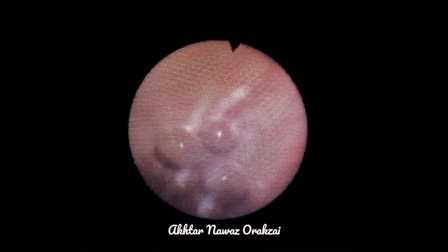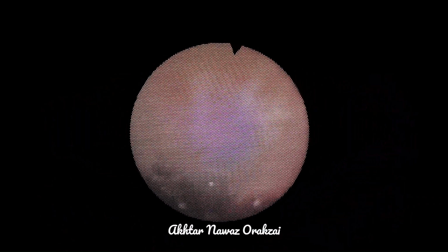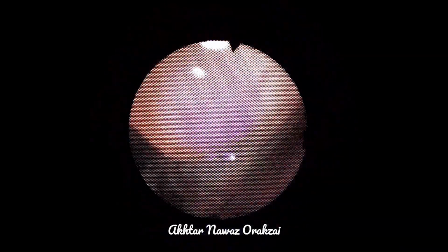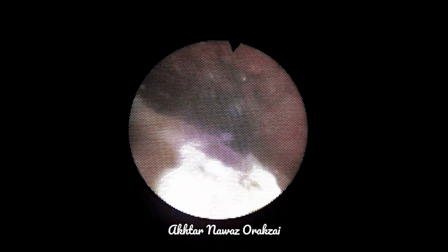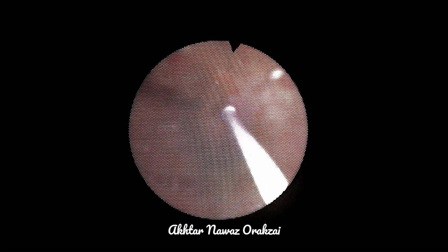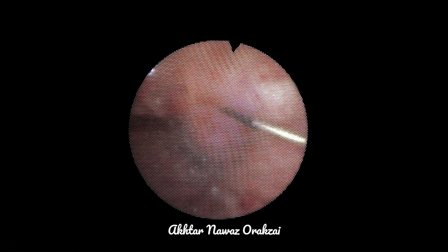Here the patient's age is around 70 years, and he had a road traffic accident where he lost one leg. He had an above knee amputation, and he made this stone. So this is the puncture suprapubically under vision, and we placed the guide wire, and then the Seldinger technique will be used.